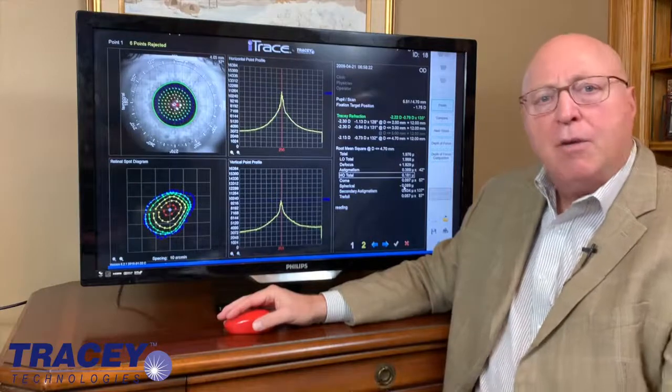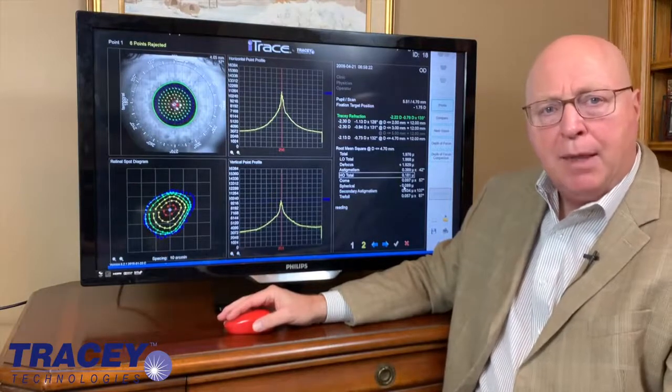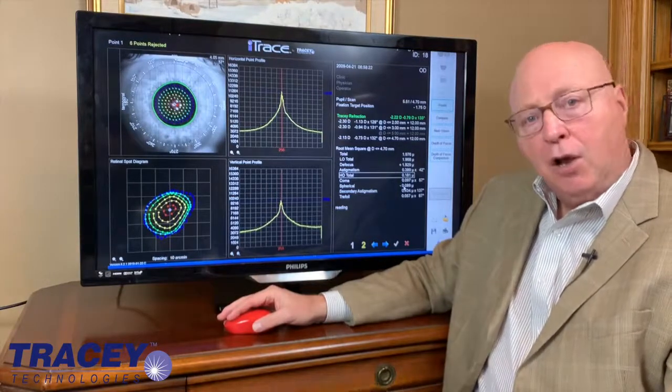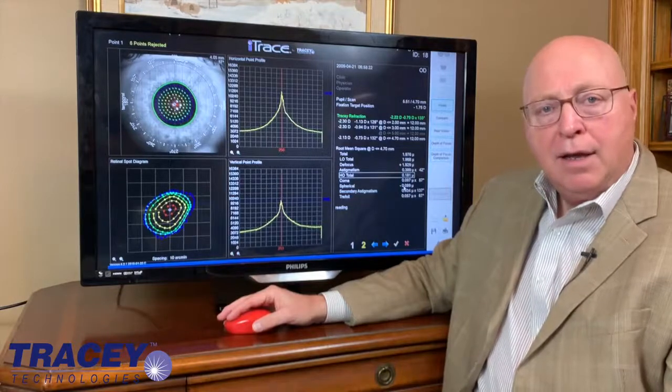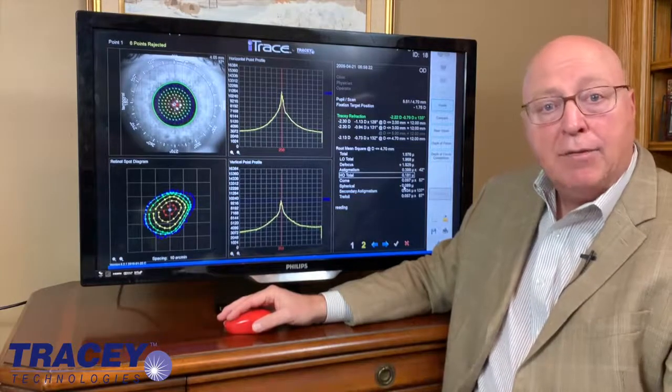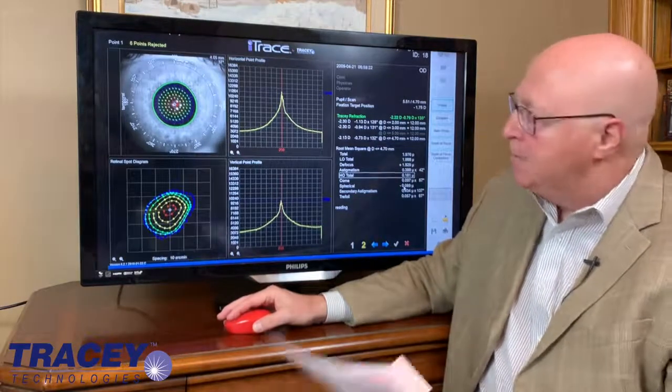So if you're concerned as a LASIK surgeon about whether you're getting a very good refraction before your cycloplegia, look for the internal lenticular. And if it has negative spherical aberration, the patient is accommodating.